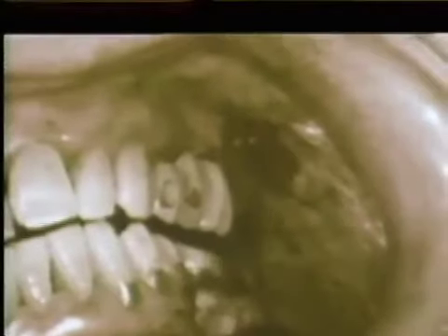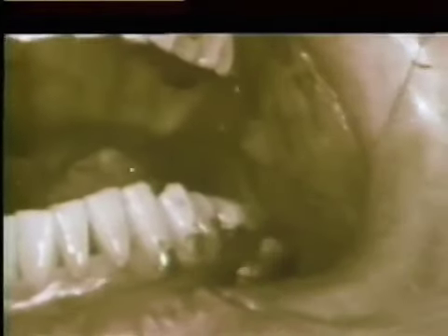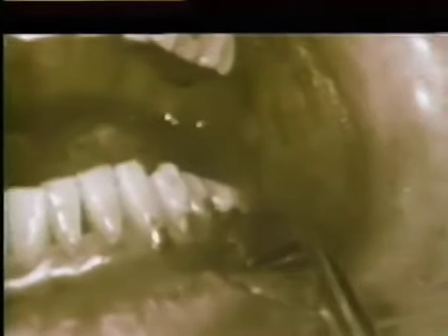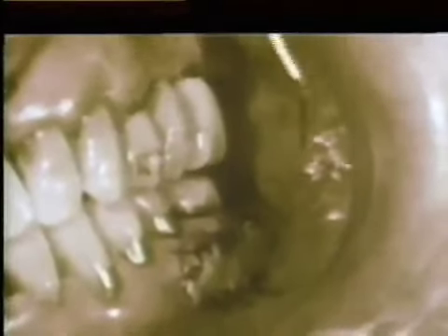The gingival graft is placed into position on the buccal surface of the mandibular molar. A suture is placed through the anterior border of the graft into the adjacent alveolar mucosa. The narrow marginal collar of gingiva, which has been left in position, will be the superior border to which the graft is secured. The suturing has now been completed. Notice that the graft has been sutured to the gingival margin, the mucosa at the vestibular fornix, and to the mucosa anterior and posterior to the site.